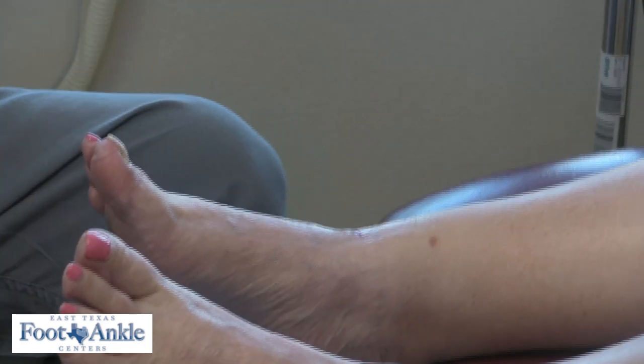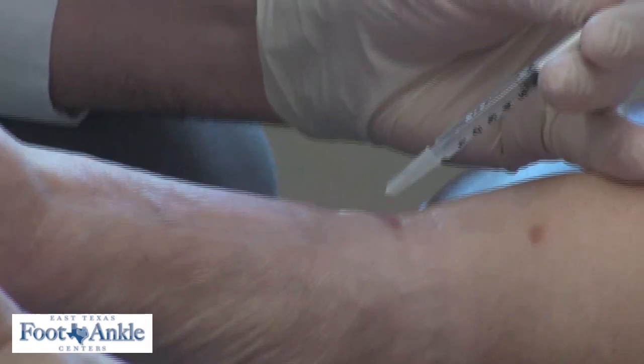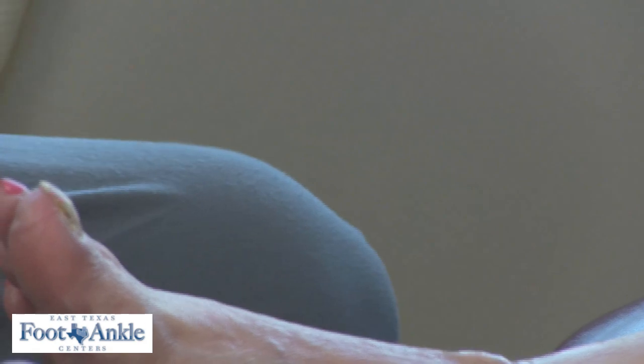It's really not that painful. What I try to do is go in distal to the mark and put a tiny little wheal right here. Usually I wait 10 minutes and then we'll come back and take it. Thanks guys.